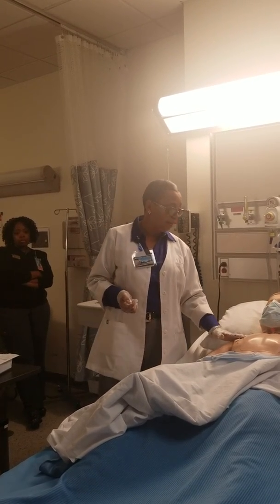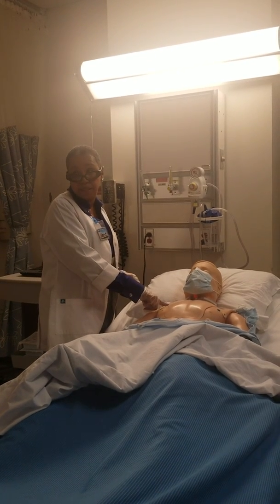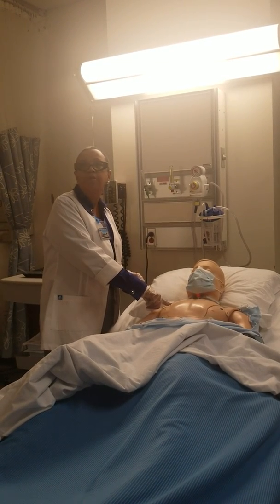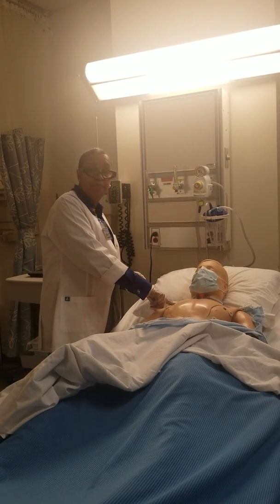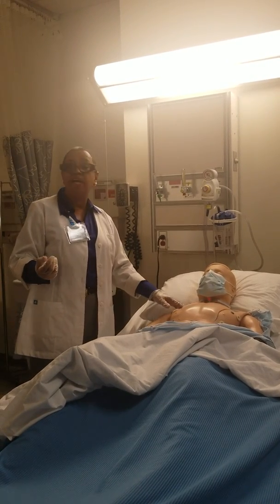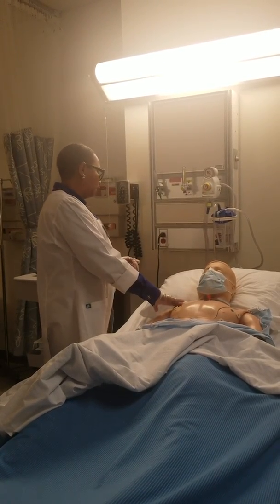Okay. So I come in, and I look to see if I see any signs or symptoms of infection. That would be redness. Is it sore? Is it warm to touch? And another thing, pay attention to the amount of drainage around this site. Is this person just sweaty, or am I getting a lot of drainage around this site? Because that may still be an infectious process. Typically, with this type of dressing, they'll be sweaty underneath, so it'll appear moist. That's okay.